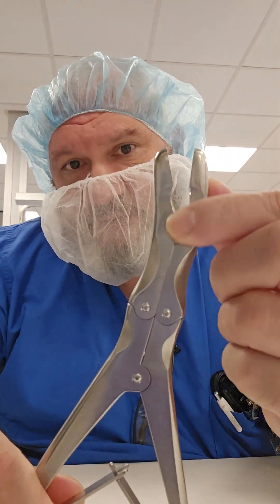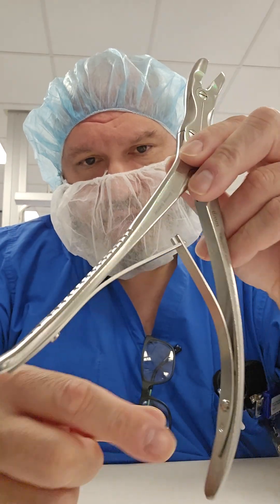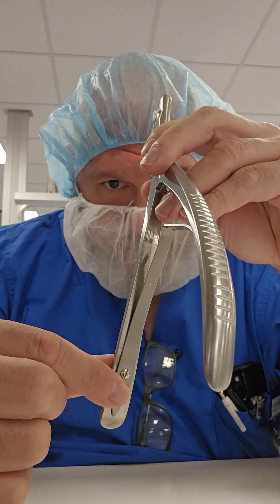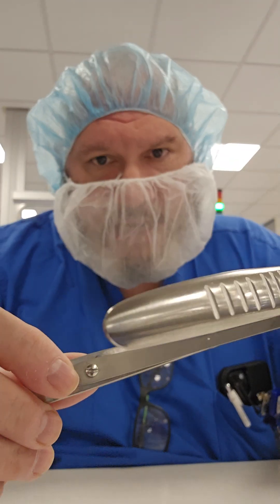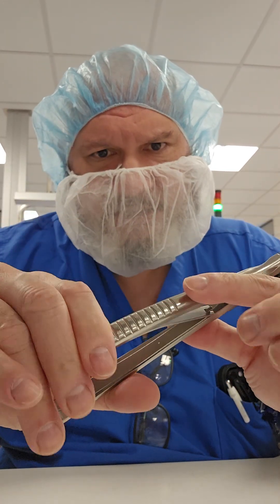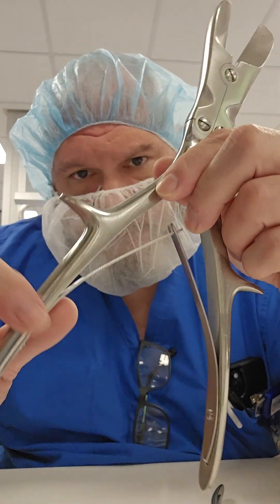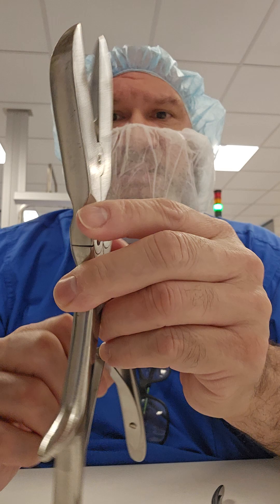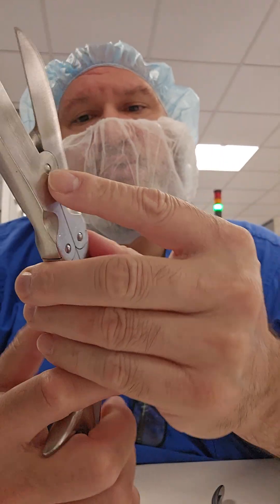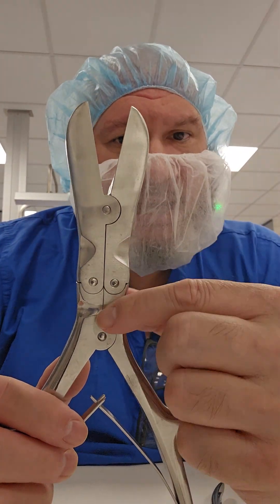Inspect those screws to make sure they're flush on both sides. Where the spring action is, look at that screw and make sure it's not backing out and that there are no cracks emanating from the spring — that's a common crack point due to constant back-and-forth action. Note that on the Liston, the screws have not been punched, so it's especially important to inspect them.